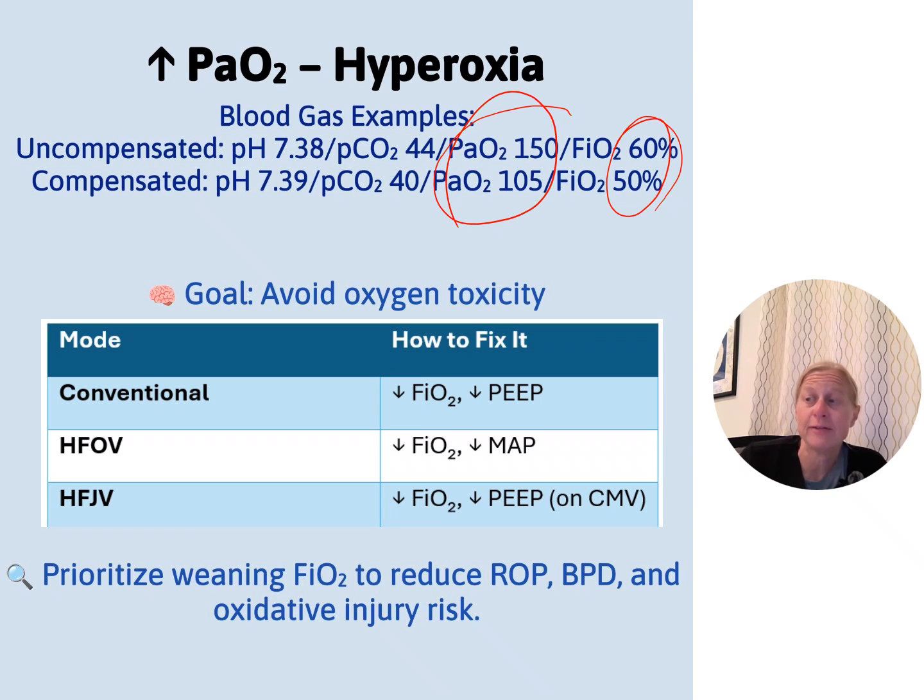And if they're not, if you're having to turn it up because you're watching your SpO2, you also need to be thinking about something like, is something going on with the heart? It could be something from PPHN all the way to a cardiac defect, especially depending on where you have your SpO2 monitor. This might be an opportunity where you're going to do pre and post ductal. We need to avoid this oxygen toxicity, especially in the setting where our gas looks pretty good.